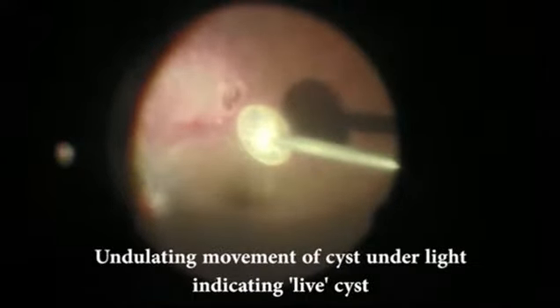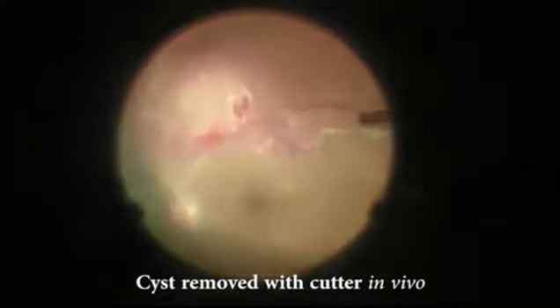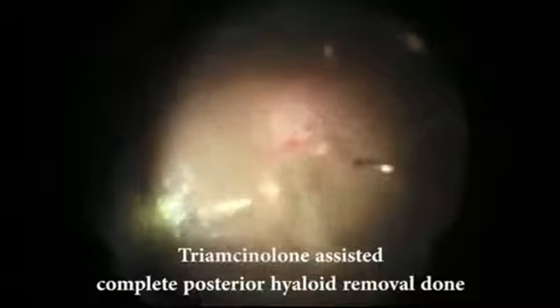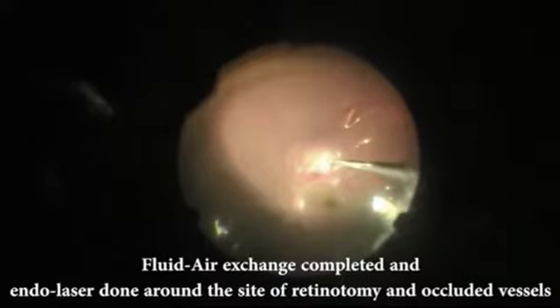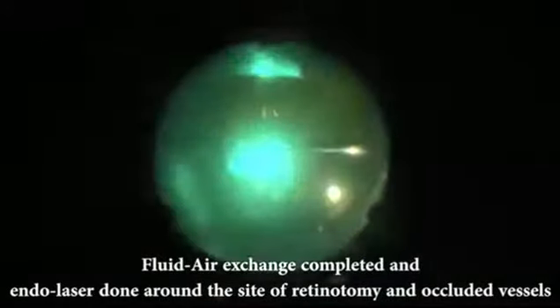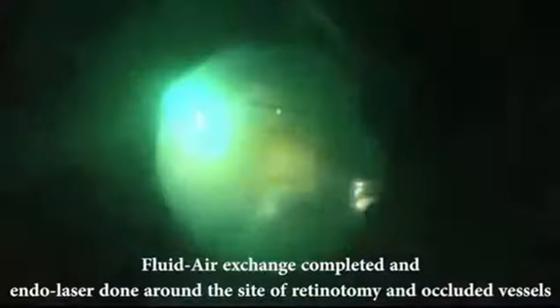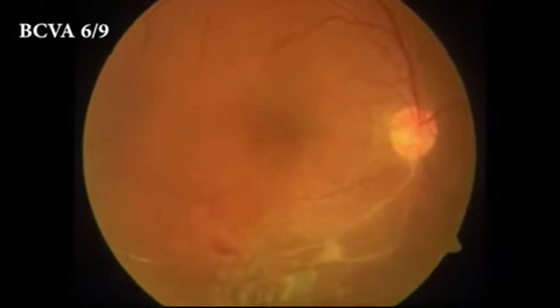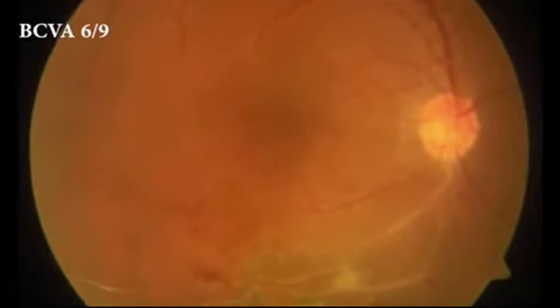The undulating movements of the cyst can be appreciated here under light, which points towards the live nature of the cyst. The cyst is then lysed and aspirated in vivo with a high-speed vitreous cutter. A fluid air exchange was done subsequently, followed by endolaser around the retinotomy site and the capillary non-perfusion areas due to the occluded vessels. Post-operatively, the media cleared and the patient attained a best corrected visual acuity of 6/9 at 6 months of follow-up.